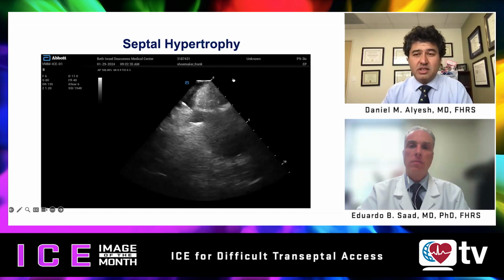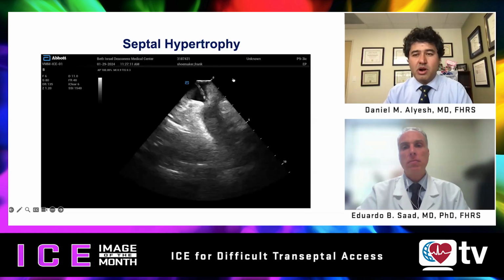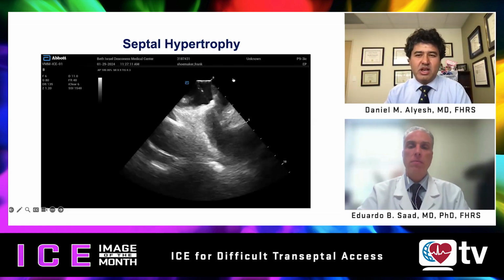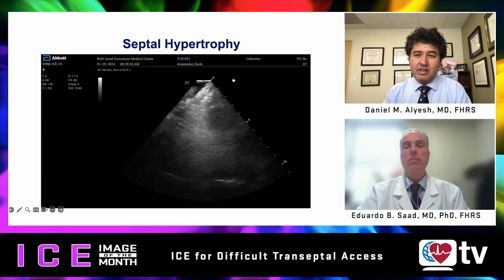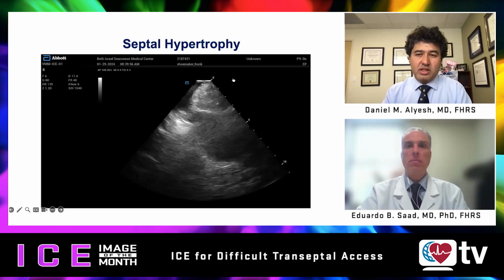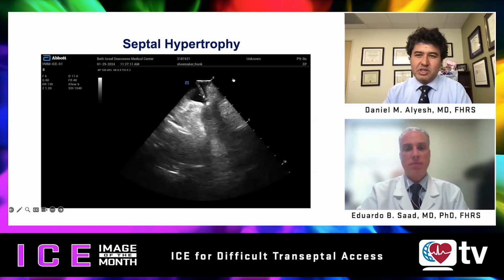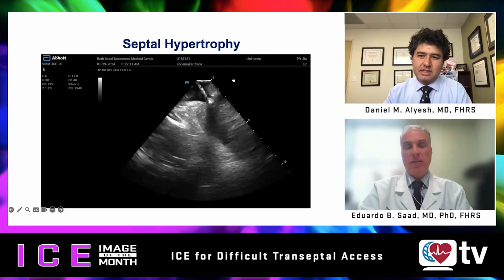And I would like to challenge our professional society as well as industry. We want to partner to make ICE's global use more prevalent, because I think these barriers are not insurmountable, right? They're educational and they're cost driven. And I think if we more globally adopt ICE, all of EP wins, and especially the patients. So, I'd like to challenge our partners to really take this to the next level. Couldn't agree more. And I think that's exactly the point.